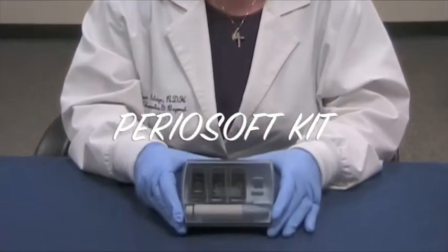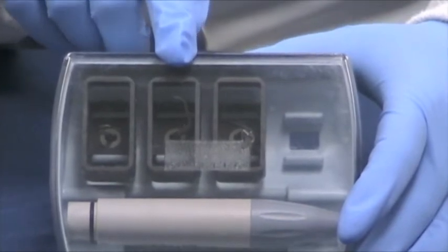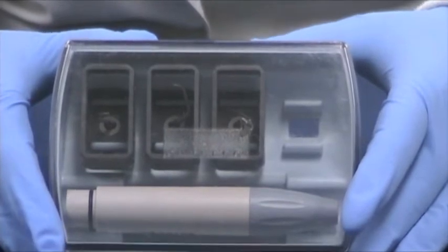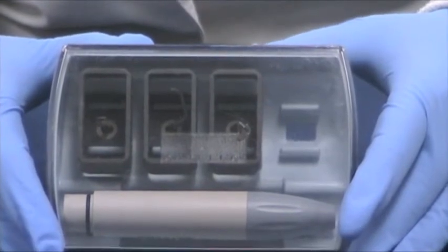The PerioSoft kit consists of three tips: the PH1, the PH2L, and the PH2R. These are carbon composite tips. They're great for implant maintenance. They're used on the green mode, or the low power setting. They're safe for implants, for crowns, and for abutments.